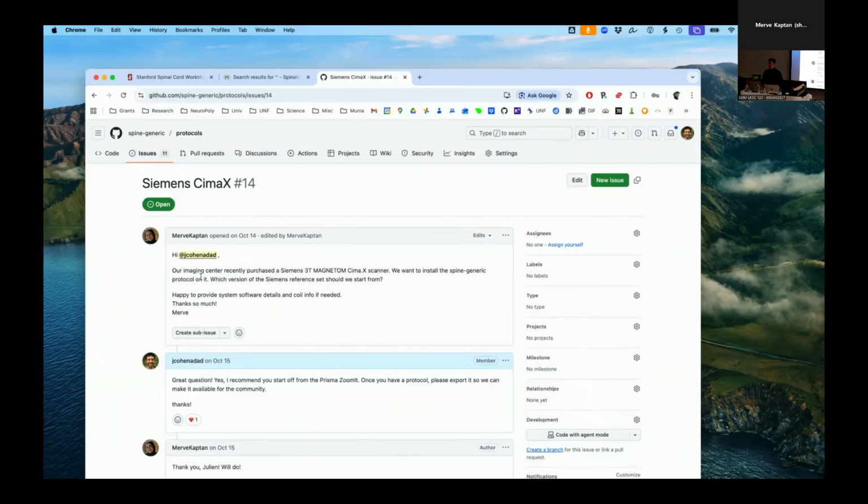Yeah, I was at a trauma hospital in Montreal 2 weeks ago, and asked the same question, because they regularly use sagittal thick slices. They don't really use isotropic resolution scans, and we like those because when we quantify the 3D structure, it reduces the bias for segmentations and so on.